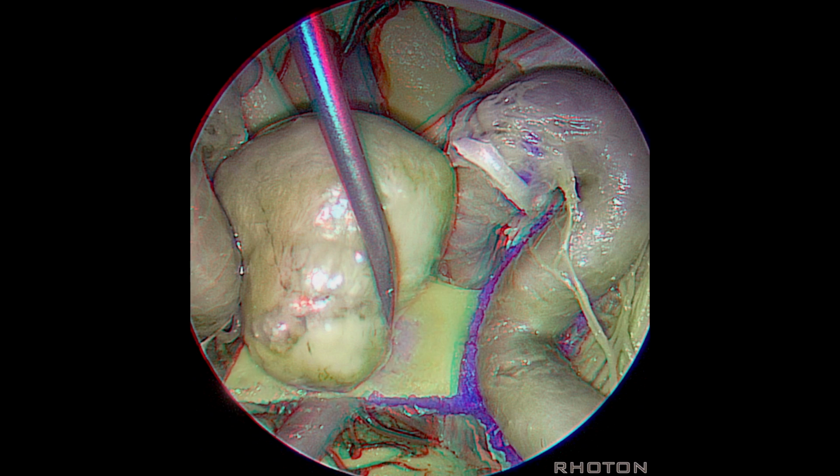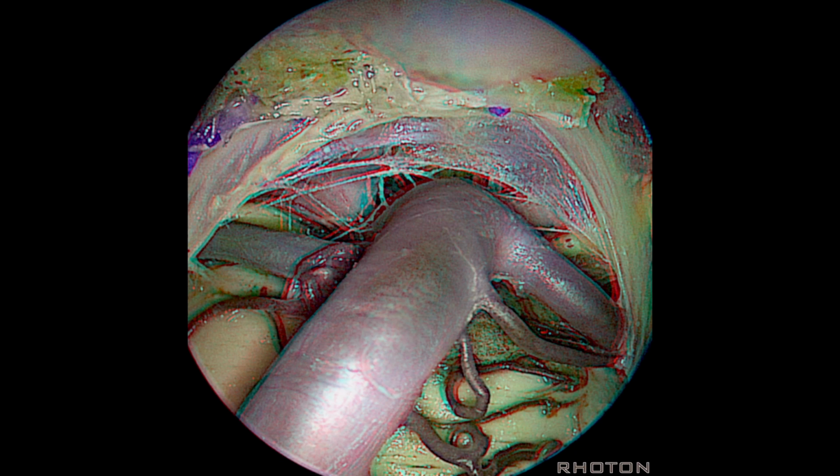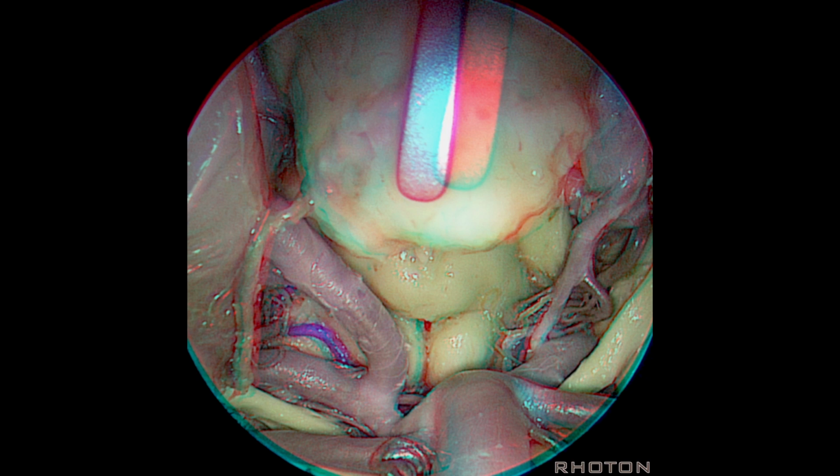and the sinus runs between those 2 layers. And then we can work along the side of the gland back to posterior lobe, along the edge of the dorsum, and then you can get in to the dorsum. Here's posterior lobe. Remove the dorsum, and you have the exposure through the upper third of clivus to basilar apex, to liliequist membrane, to posterior communicating, P1, posterior cerebral, mammillary bodies.